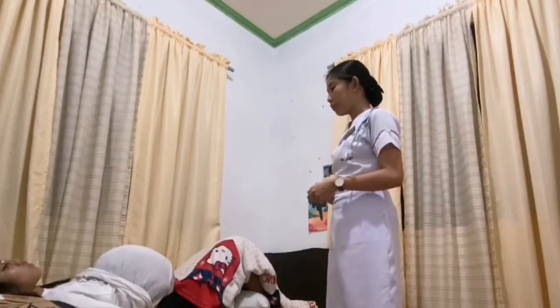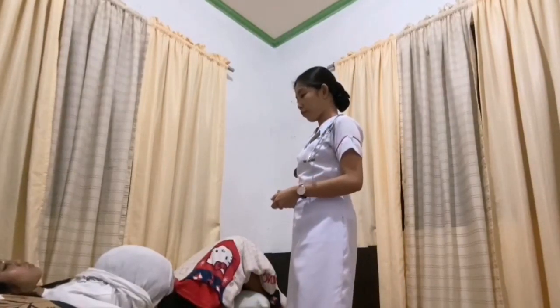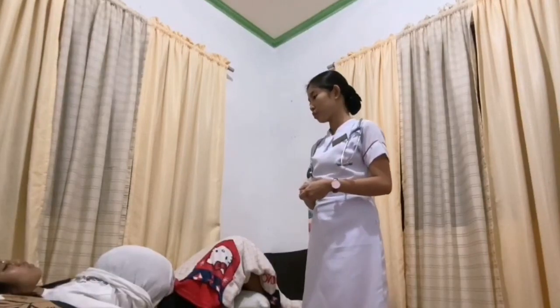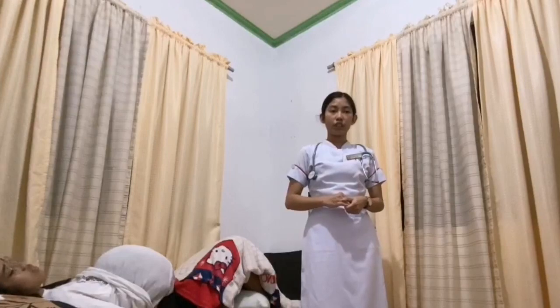So, ma'am, the FHT po is 140 beats per minute, which is in the normal range, which is 120 to 160 beats per minute. After that is to make the patient comfortable. This is to provide comfort to the client.